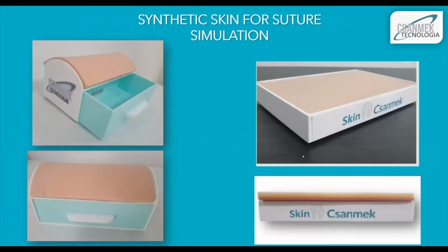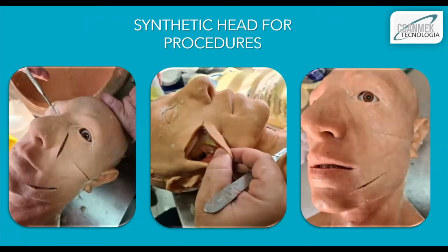And here's another solution we have for just suturing. It's more portable and cheaper as well, but we use the same scheme we use in the other model. The difference is this is in a box and the other is in a human body. Here's another synthetic head for procedures. You can definitely use that also for evaluation, for suture, for planning. We can build and customize those kinds of solutions.